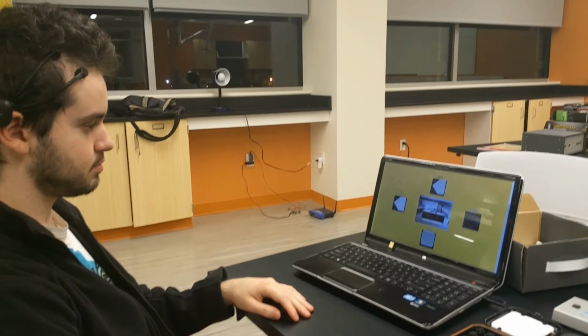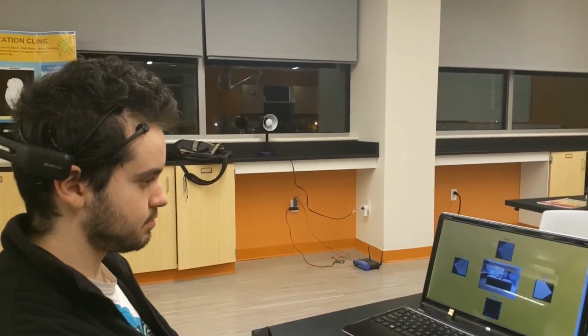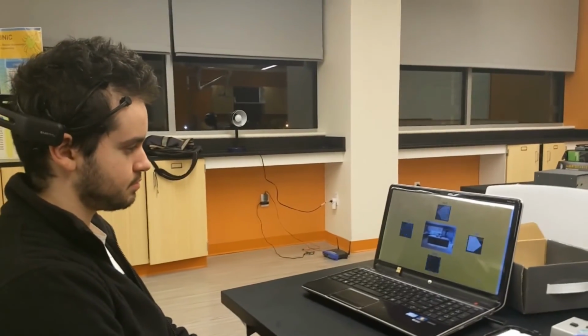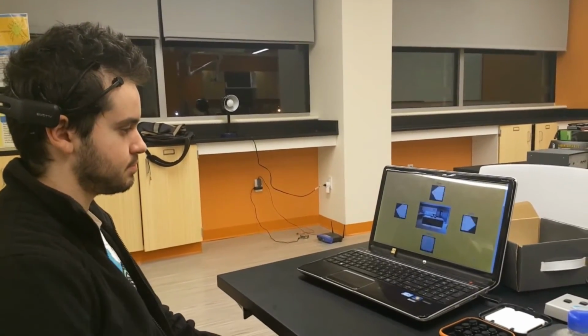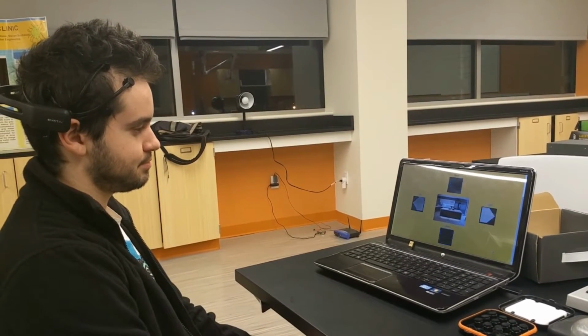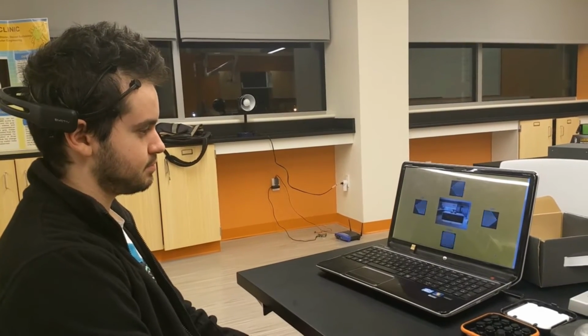Our algorithm determines if the user is looking at the button by 3 criteria. If the peak frequency occurred at the same frequency for 5 seconds straight, if the peak frequency had a magnitude at least 4 times the average of the other frequencies for 5 seconds straight, and if it occurred at one of the 4 frequencies of the buttons.